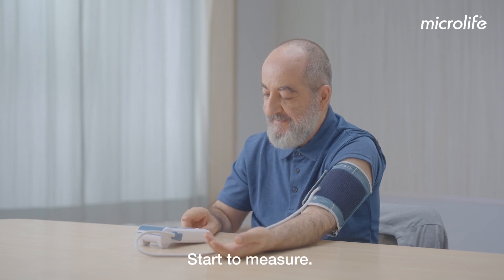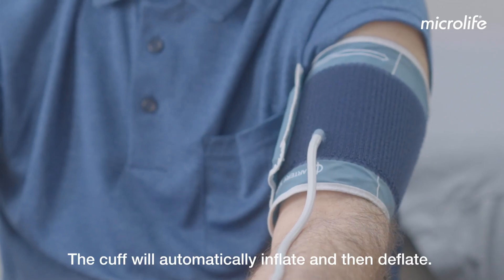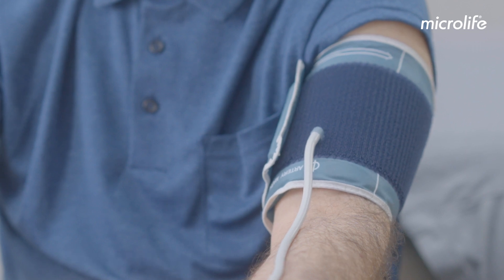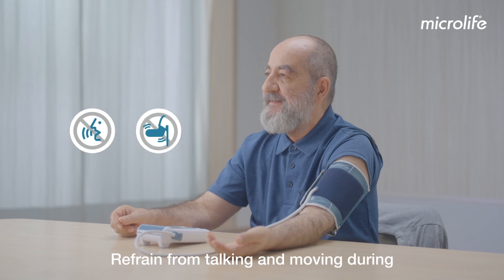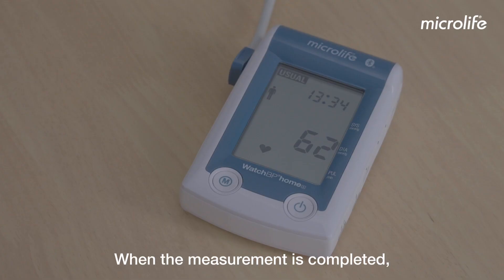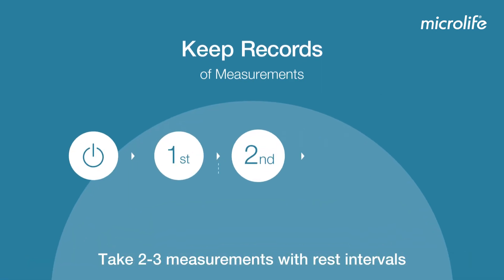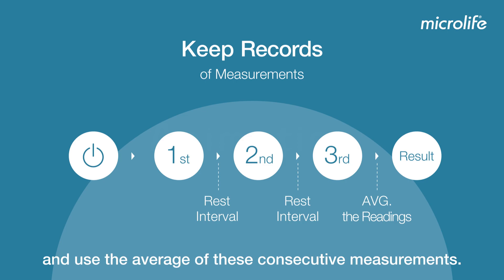Start to measure. The cuff will automatically inflate and then deflate. Refrain from talking and moving during or between measurements. When the measurement is completed, your blood pressure readings will be displayed on the screen. Take two to three measurements with rest intervals and use the average of these consecutive measurements.